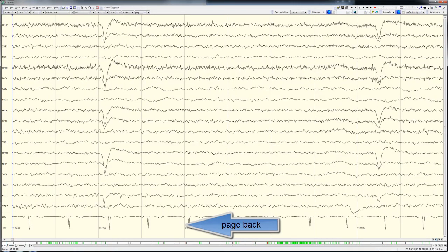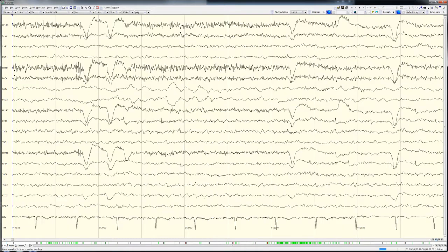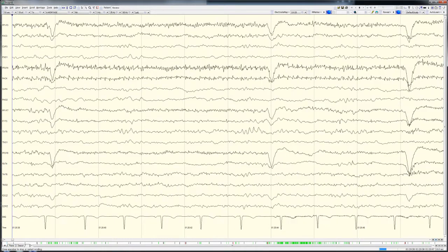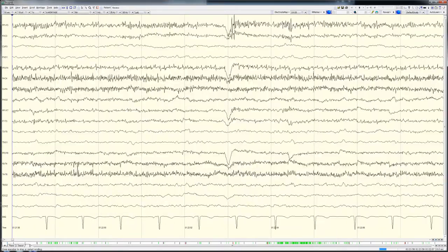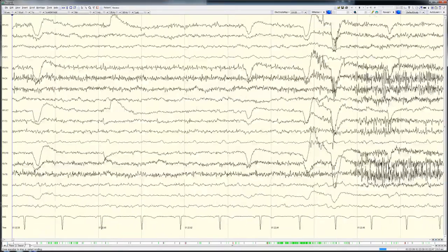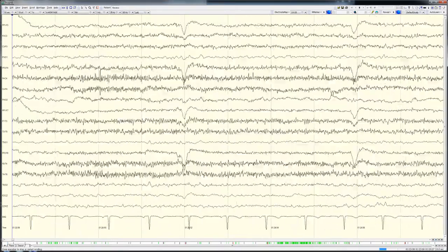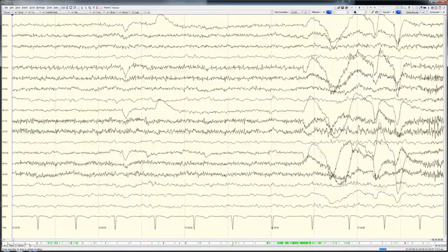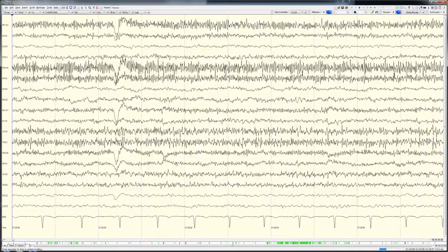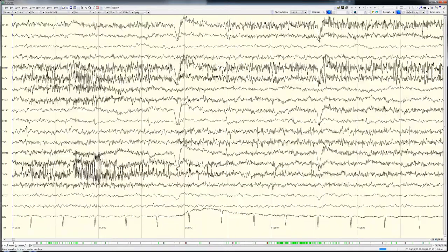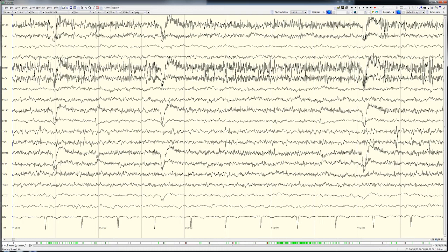The expert reviewer who performed the initial visual review of the raw tracing in this case recognized only five of seven seizures present in the recording. The two seizures that eluded recognition during standard visual review were briefer, more subtle, and had different spatial distribution than the other five seizures. Those two different seizures were identified only through review of the EEG trending graphs.